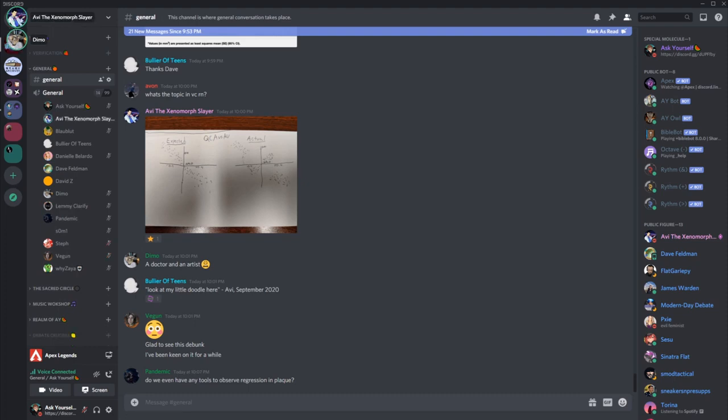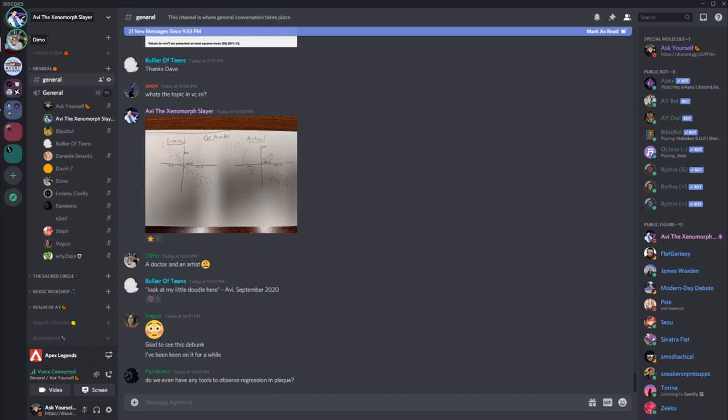So at the end of the day, QCA has utility, it has value. It all depends on the question you're asking. If you're asking the question of, can I get a geometric assessment of the lumen of this artery, or where the blood is in three-dimensional space, yeah, you can get something like that. If you're asking, can I assess a change in plaque with QCA without high cut points? The answer is no. It hasn't been shown. And as a continuous variable, it has been shown to be no overall.